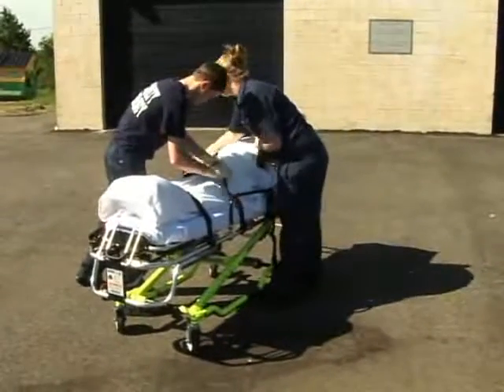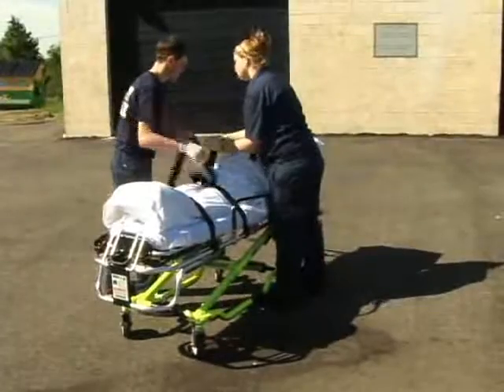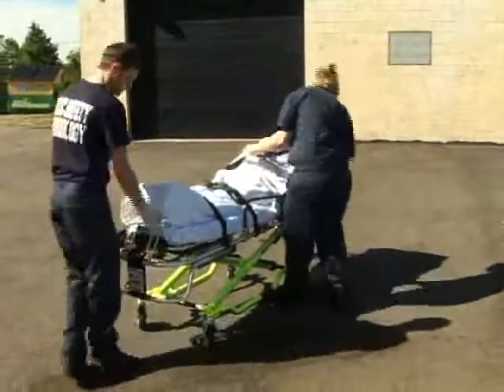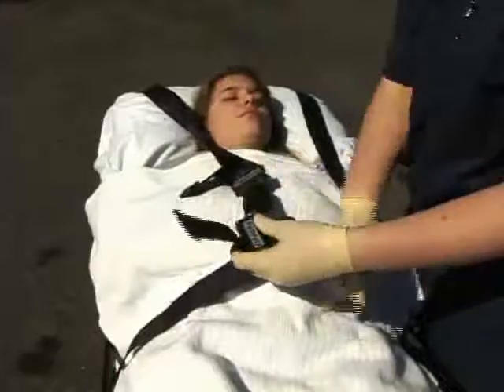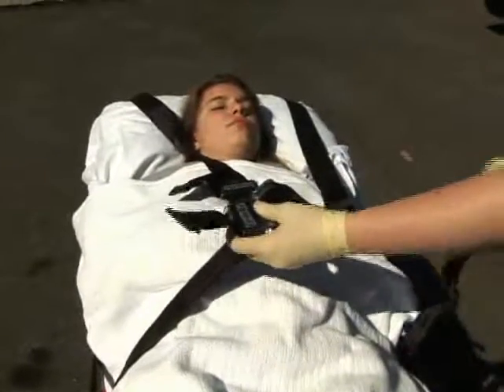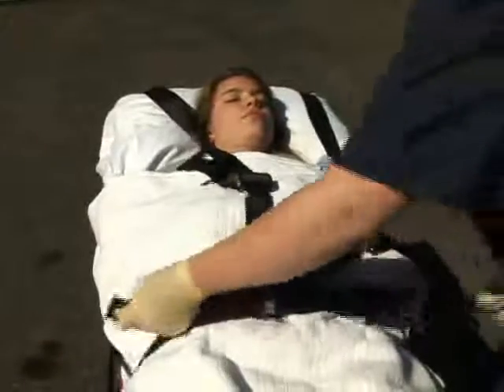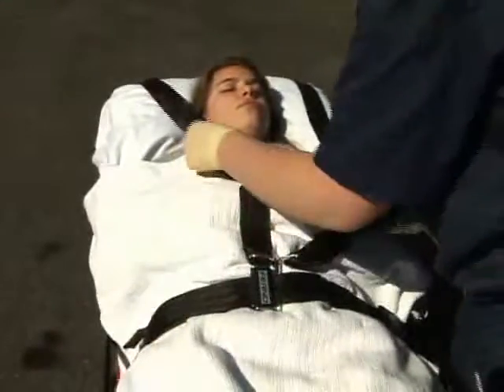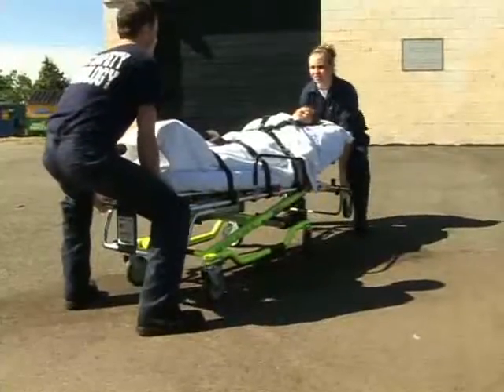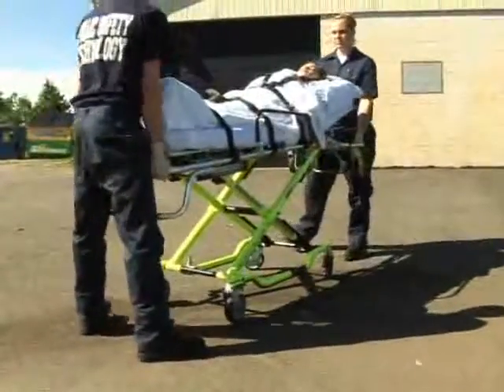Place the straps on the patient's chest and thighs and secure. Lifting from the head and foot of the patient, raise the cot to a position of 3, 4, or 5.